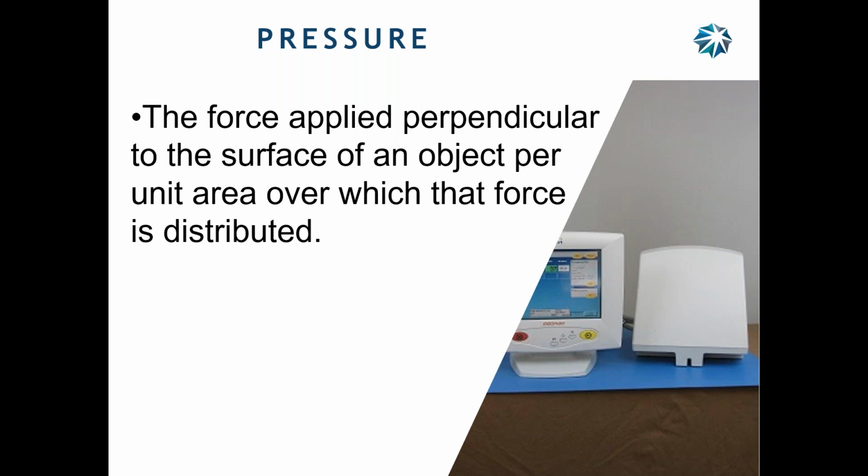Now, do you hit max pressure when you inject? No. Nowhere near it. Okay? The tubing can absorb up to 150 psi. The length of the tubing can absorb 150 psi. So with that being said, the pressure pushes, you need the flow rate to push the pressure.